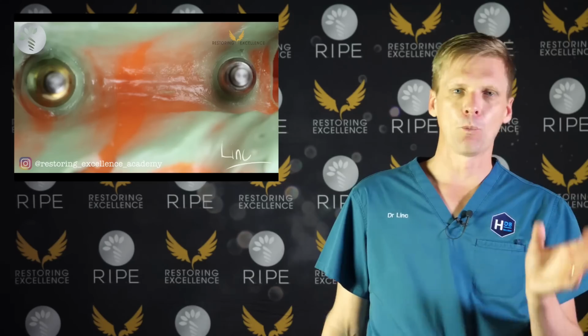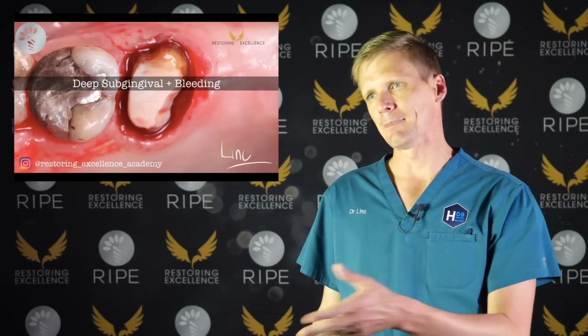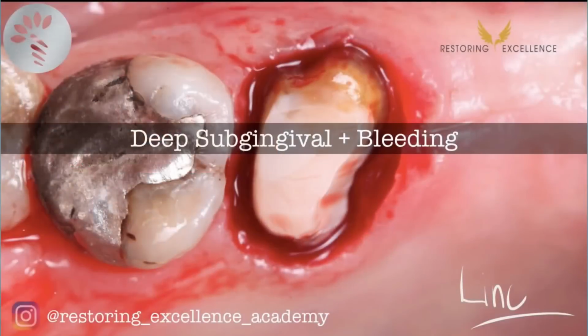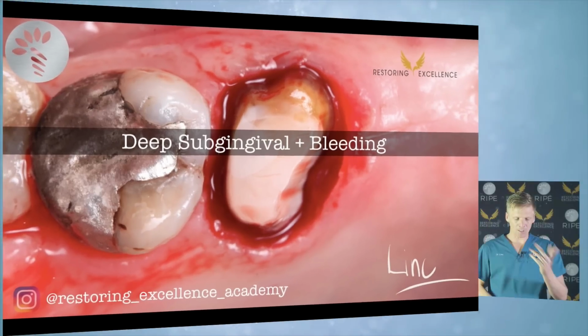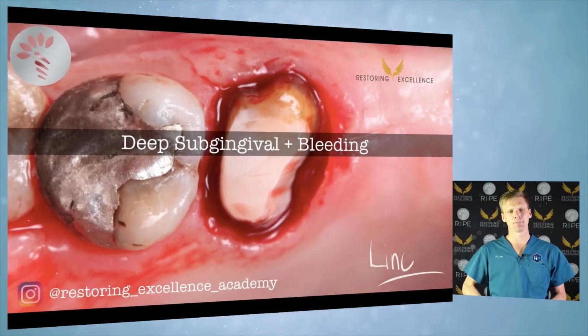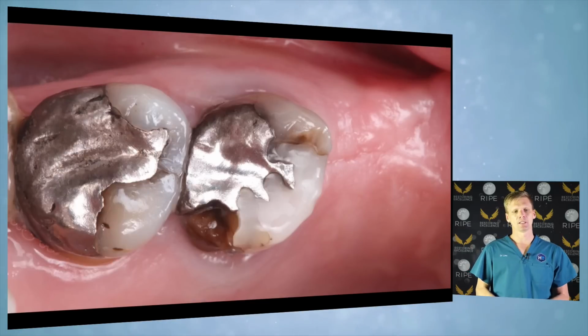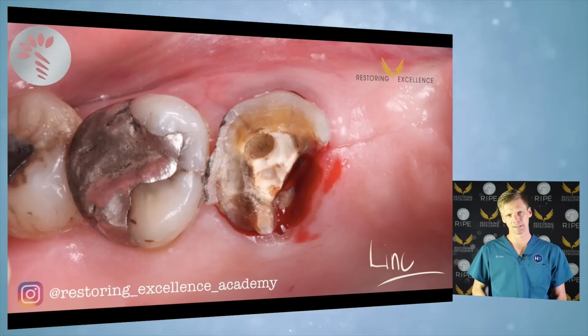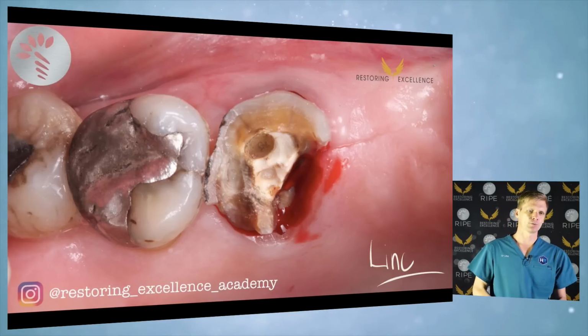Deep bleeding. Some people will say you never do subgingival, you just do crown lengthening on everything. That's not realistic in 99% of our practices. But if you do vertical preparations, you are definitely going to do deep subgingival margins at some point where it is a bloodbath. So here's a typical case. It looks like this, but when we take out the core, the previous restoration, we see it's suddenly really deep. So we thought it was okay, but suddenly it's really deep.